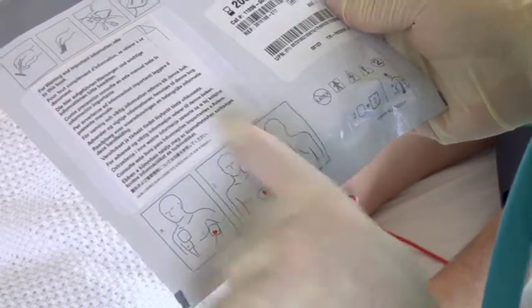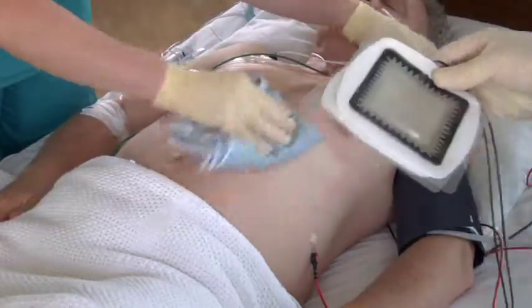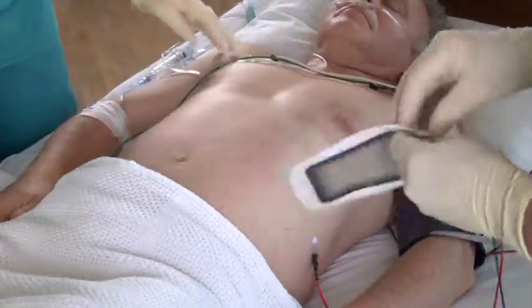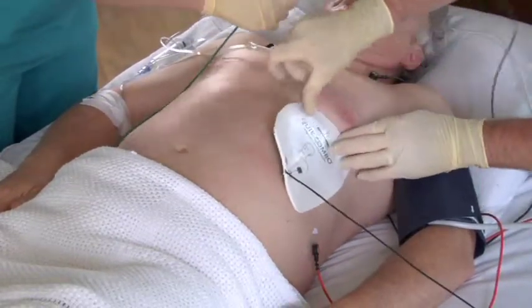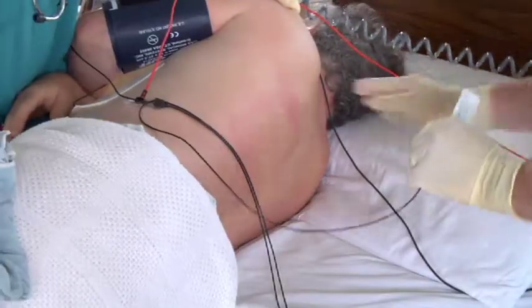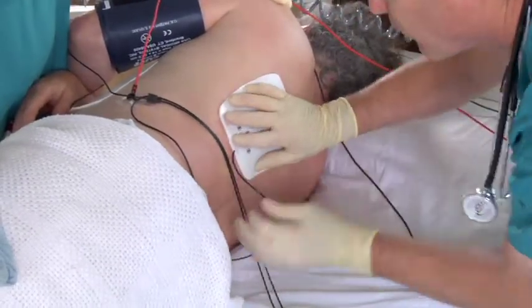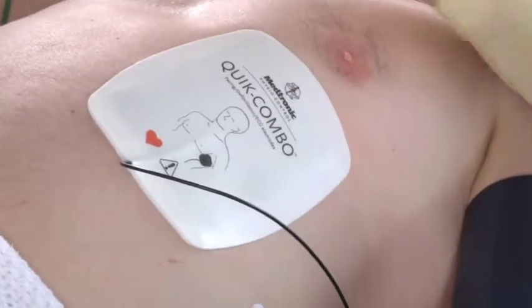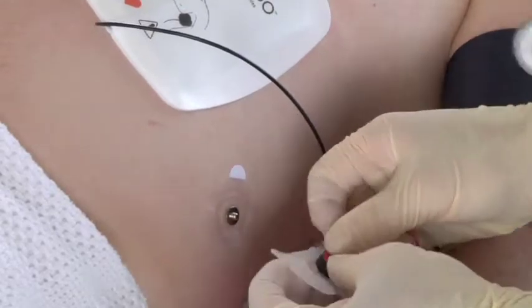We'll use anterior-posterior here. You can use either the anterior-lateral or anterior-posterior position. Prep the skin as we showed you in the ECG monitoring section. Place this electrode with the heart over the left precordium, just below the nipple. It's important to put the electrode with the heart here rather than on the back, because if the electrodes are reversed, it might require a higher current to achieve capture. Place the other electrode on the patient's back in the infrascapular area, like this. Be careful to keep adequate separation between the ECG electrodes and the therapy electrodes to minimize artifact on the ECG.